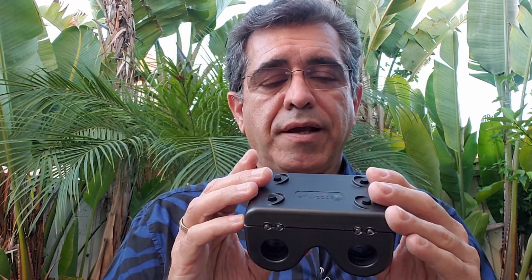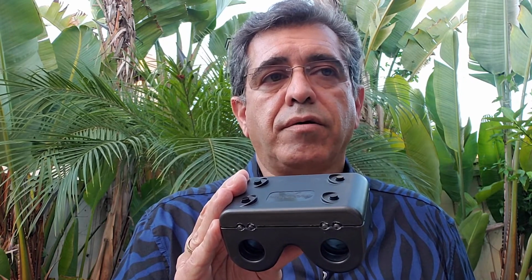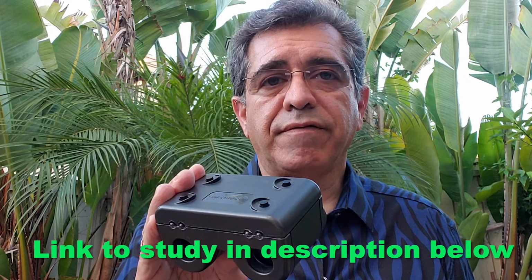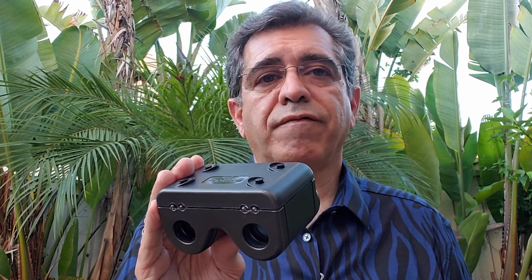But once you do get it, it is a better way than the swinging flashlight test. In a study published in the Journal of Ophthalmology and Clinical Research, APD tester was found to be more sensitive and reliable than using a pen light with the swinging flashlight test.